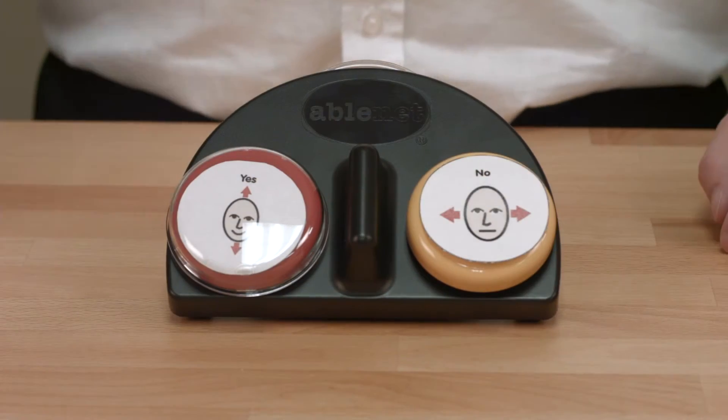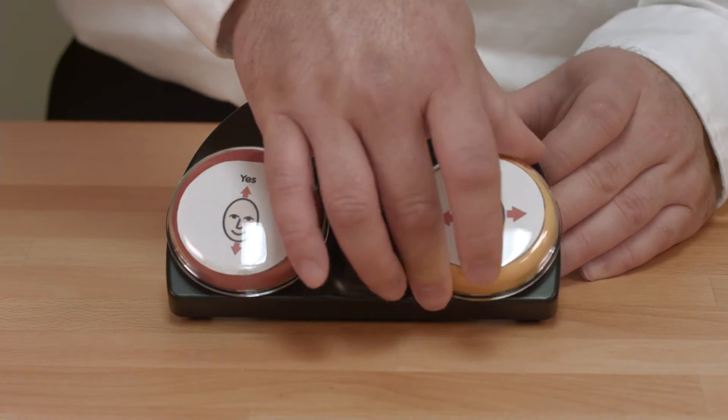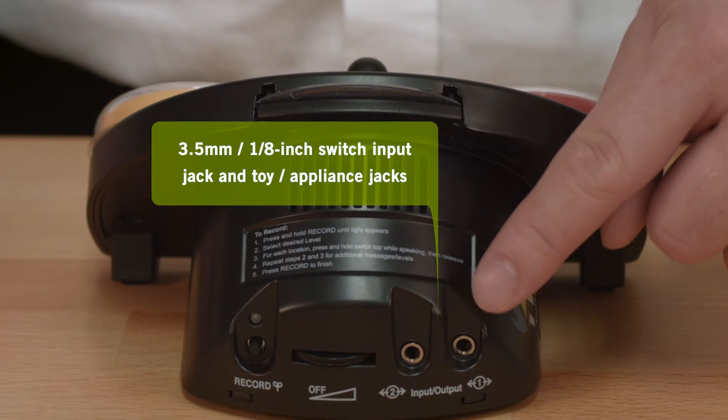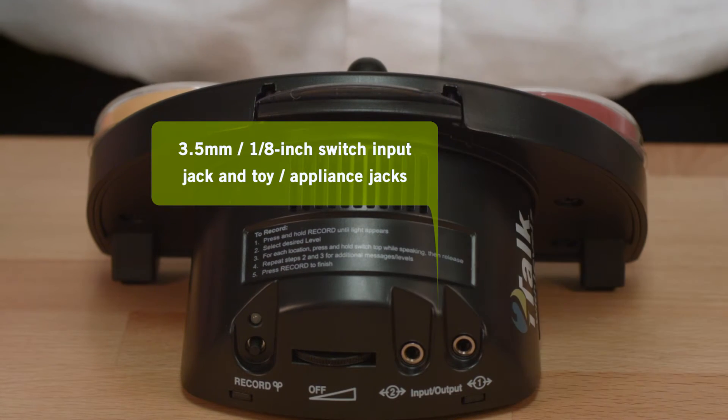Picture symbols help to reinforce what will be said when the switch top is activated. Two three and a half millimeter one-eighth inch switch input and toy appliance output jacks can be found on the back of the device.